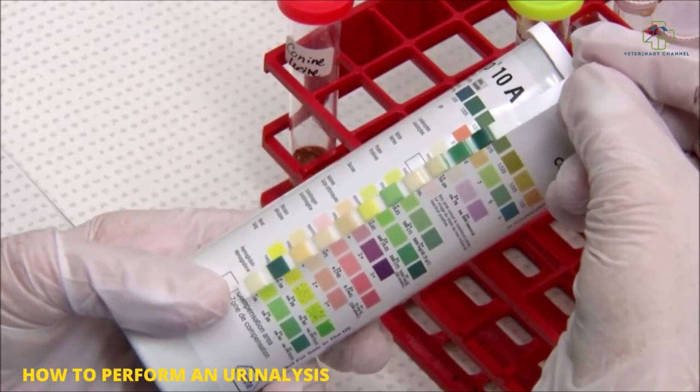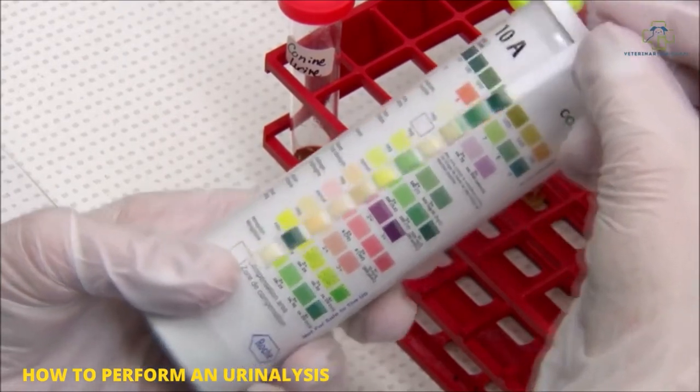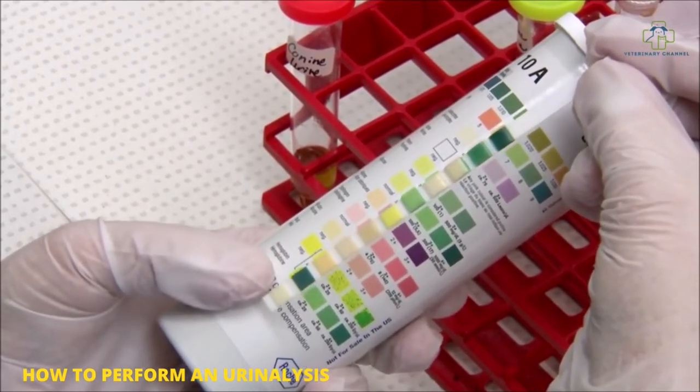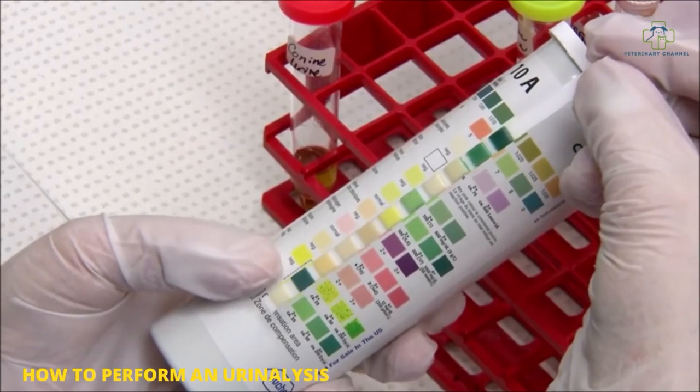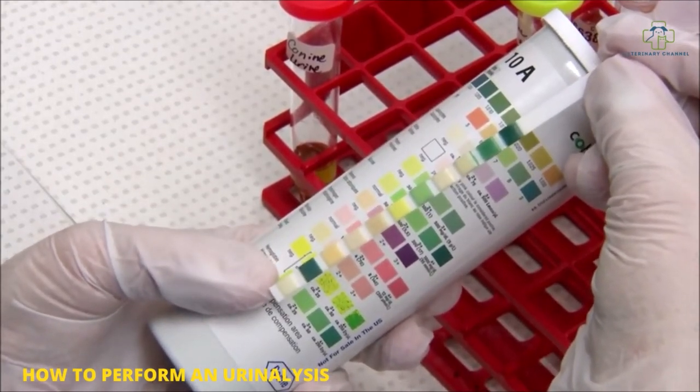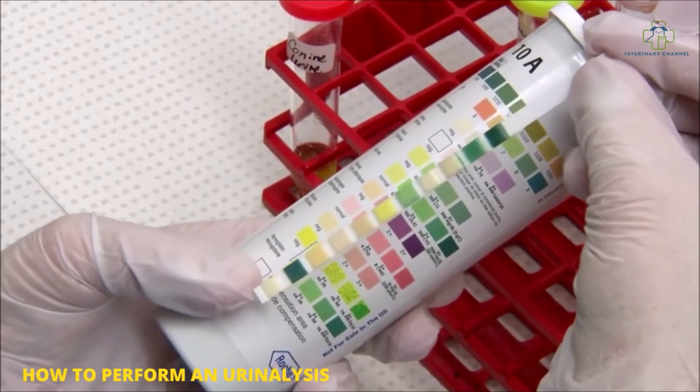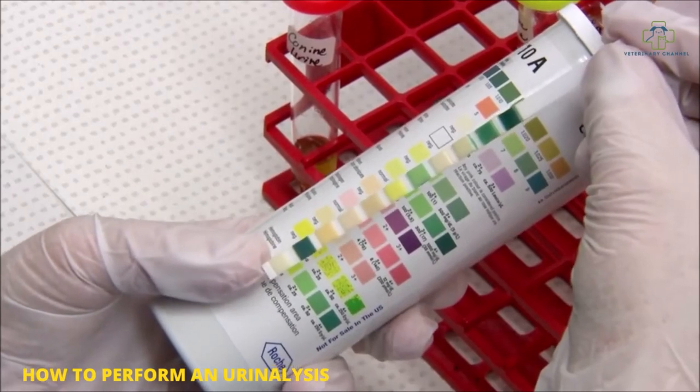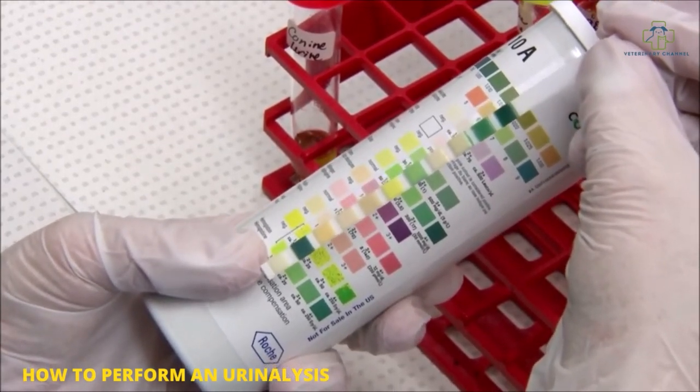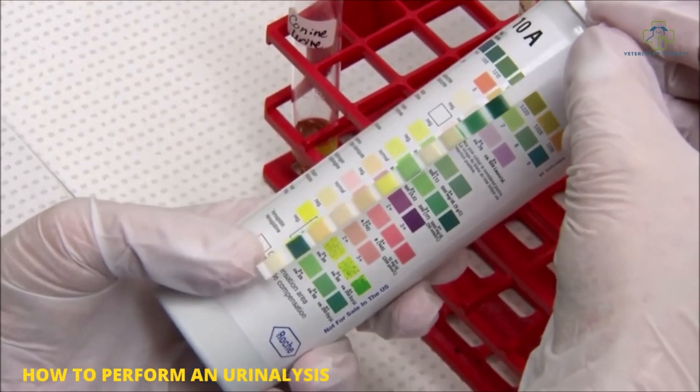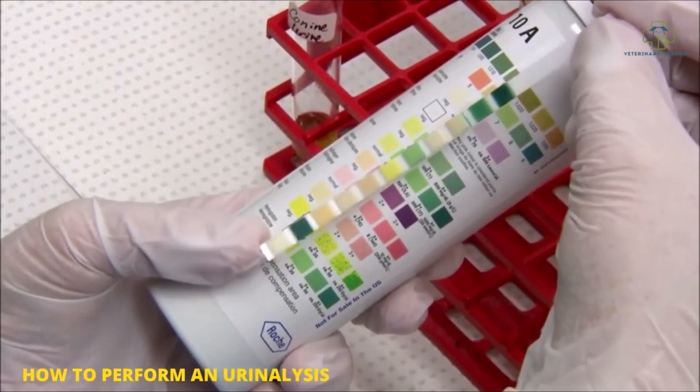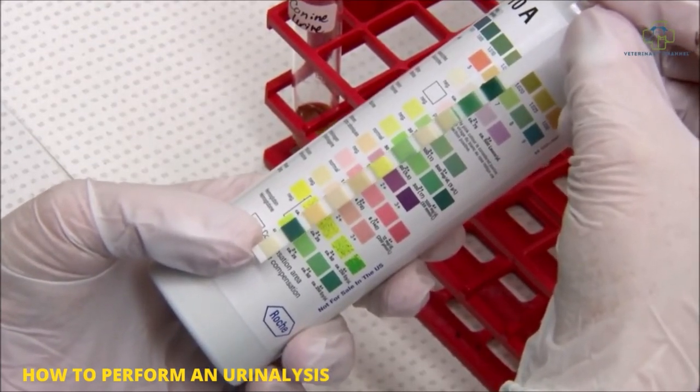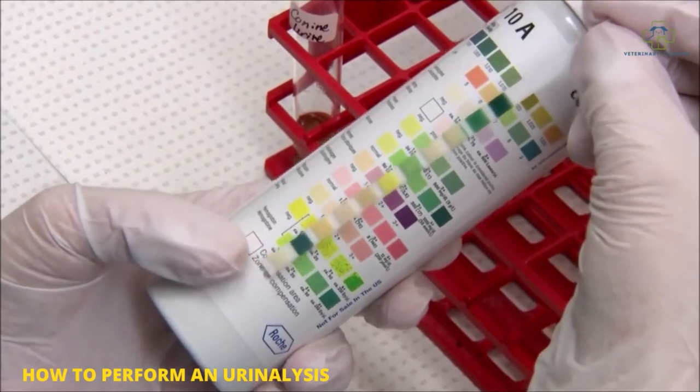Bilirubin is reported as negative up to three plus. For blood, you're going to have one square on your strip and two squares on your strip container. The speckled one is the intact red cells, the solid one is the hemoglobin. We don't differentiate it; we just report it up to three plus and greater than three plus if blood is actually visible in your urine. Read all your reactions within 120 seconds.